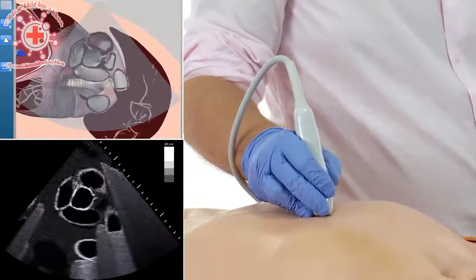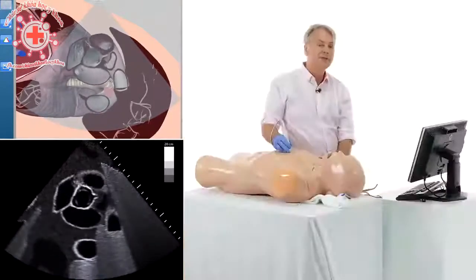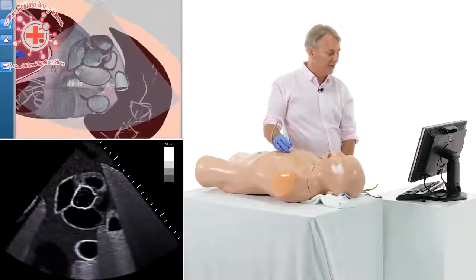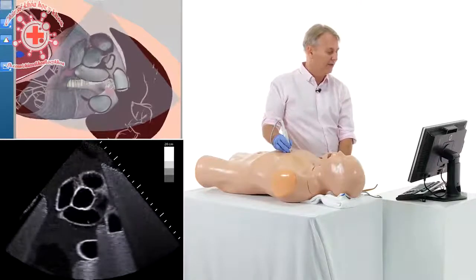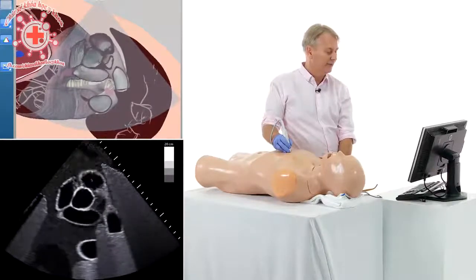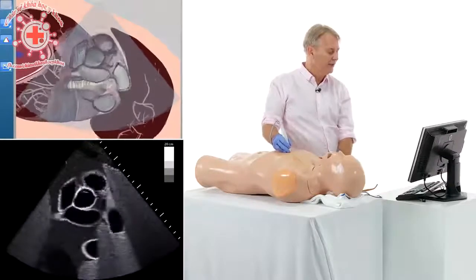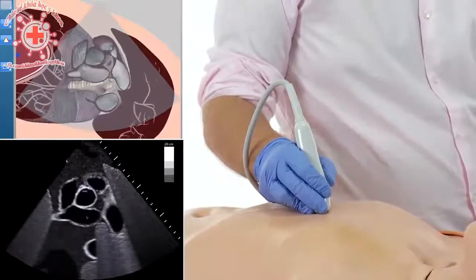Now, the right coronary artery is usually easier to identify than the left coronary artery, and it also depends, of course, on the size. What else can you see in a short axis view? Well, obviously the structures that you probably already know, the left atrium, the right ventricular outflow tract, but if you tilt a little bit back and forth, you can even see the pulmonary veins, how they enter the left atrium.